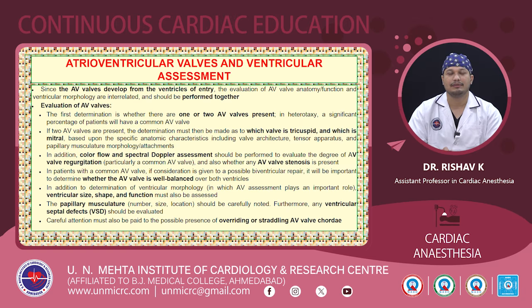Also, the mitral valve is usually oriented a little bit superior compared to the tricuspid valve. So we can easily determine the valve identification by using these simple points. In addition to the 2D assessment, we have to perform the color flow and the spectral Doppler assessment.